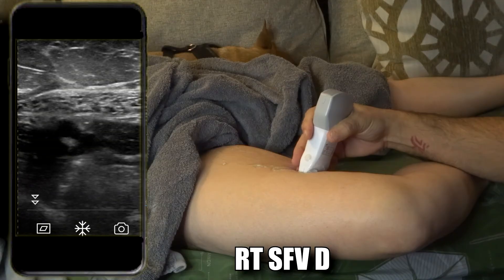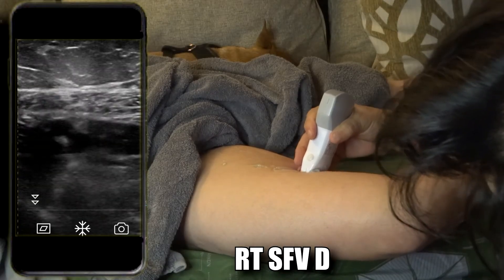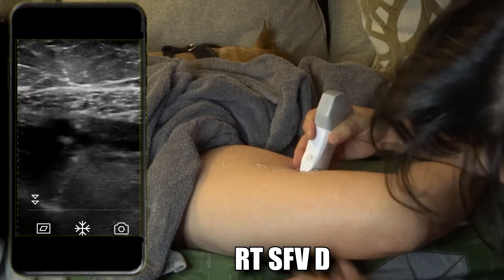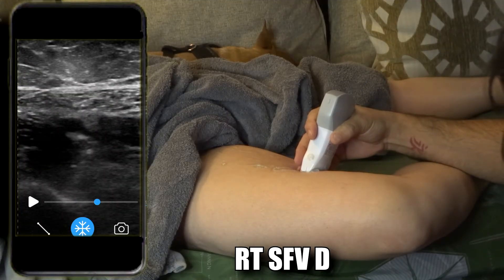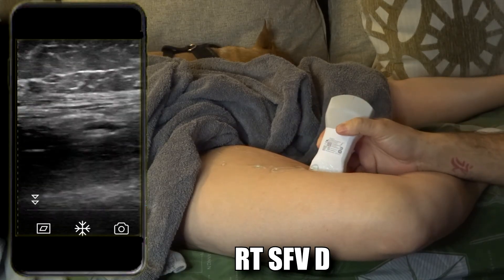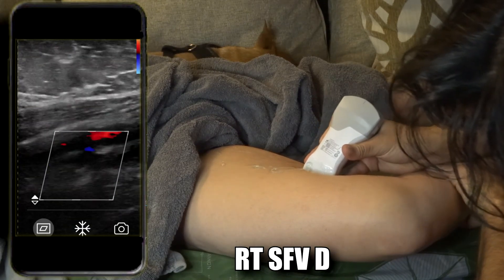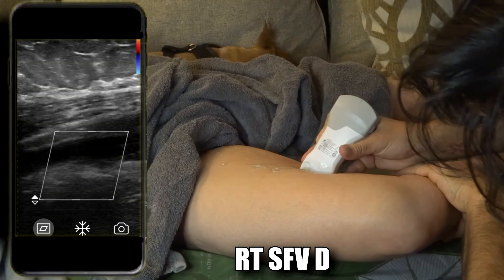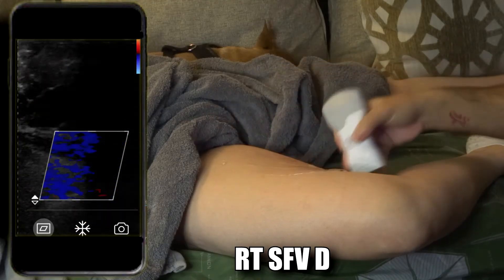Now go to the distal femoral vein. Increase the TGCs so you can see a little better, take the picture, compress. At the distal femoral, when the femur is in the way and doesn't allow compression, come in from the back and push both ways — that usually makes it easier to compress. Rewind back to where it's compressed, take that picture, unfreeze, and go sagittal. I tried to turn airplane mode on and it disconnected the probe, so I had to reconnect. Back in the distal femoral vein — give it an augmentation, little squeeze — freeze, rewind.